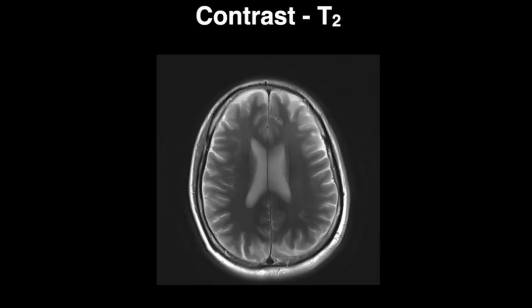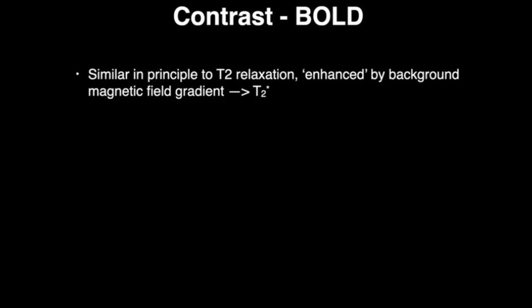And then what we do for BOLD is very much related to this slight variation. Where BOLD contrast comes in is it takes this idea of coherence of your signal, but now it looks at the decay with macroscopic or semi-macroscopic background gradients coming into play.